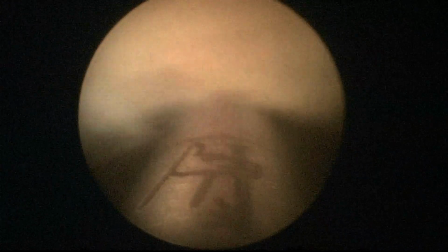I'm trying to keep the morcellator tip a little bit inside, you see, to make sure that it is well introduced in the bladder. Keep it in the center. Because sometimes if you try to work very close to the lens, the adenoma is going to collide with the tip of the scope. So you need to go a little bit further than you might intuitively feel it's safe at the beginning of your experience. But my scope is a little bit tilted up, and I have two corners, you see, at the side of the morcellator blades that are quite black, which means that there's no bladder nearby.